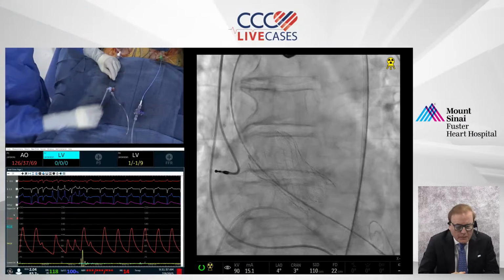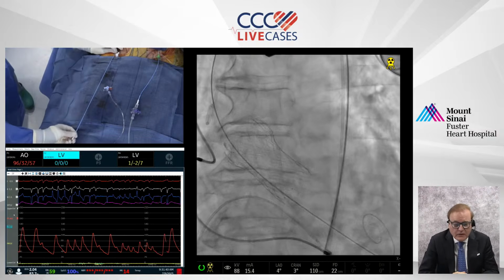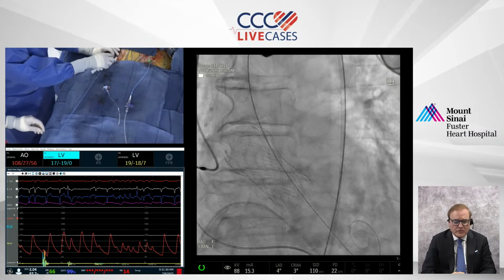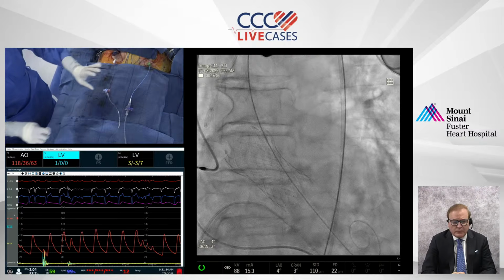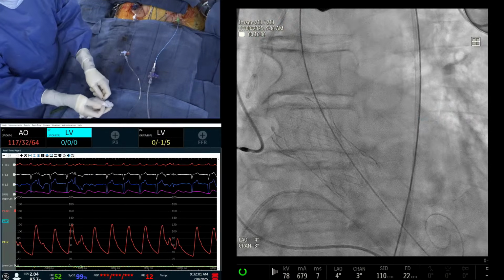Mohammed Ali. Yeah. Mohammed Ali, he says, why not PVL closure? And can you show the CT where the defect is? I mean, we already did that. Left sinus is big. That's his whole discussion about the PVL closure versus the new valve, and we already went through it. Yeah, that's a great question, and I think I already answered. If the sinuses are generous, you can close it. Show the slides again, yeah.